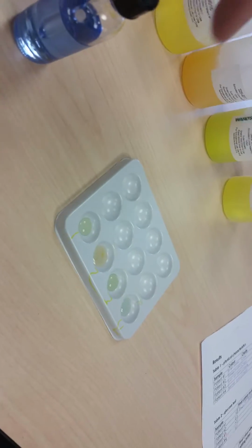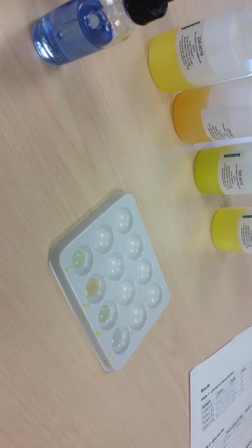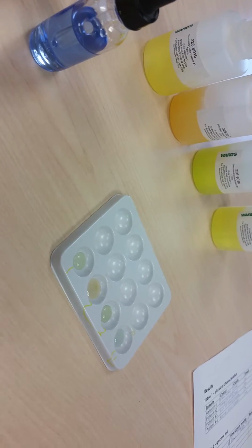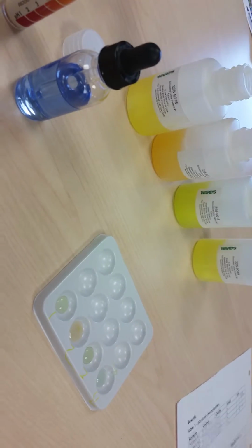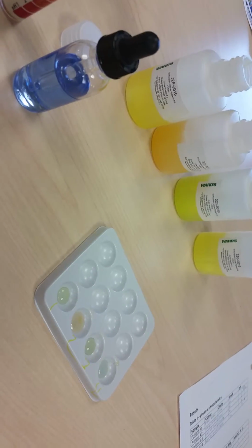The last thing that people would do in this urine test would be to actually make microscopic slides and look for what we call casts, which are like cells, and also crystals. And you can tell what crystals are present by the shape that they make when they dry on the slide. Because this is simulated urine, we're not going to actually make slides.